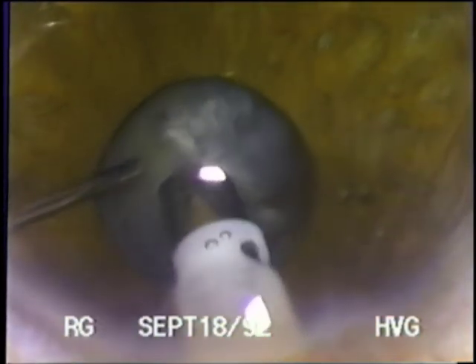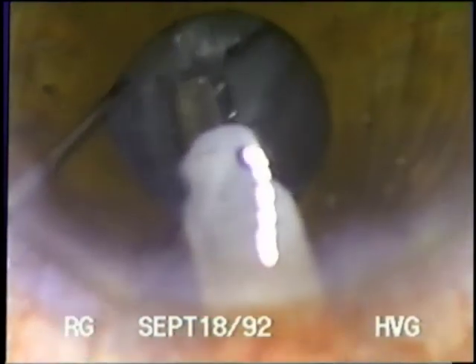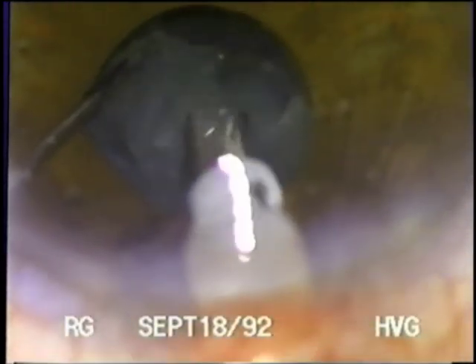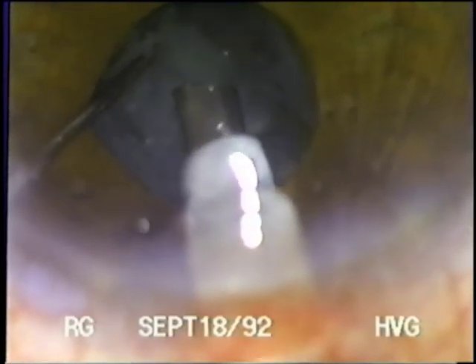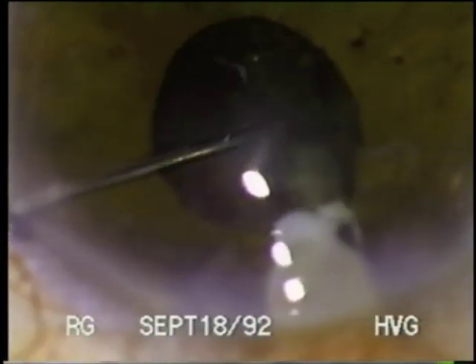The risk of the iris flowing unexpectedly with the lens material into the tip of the phaco port is thus reduced. If the tip is under the capsule or iris, it is usually in irrigation aspiration mode only. It is mandatory to use a lower flow in small pupil cases. It reduces efficiency but increases the safety of phaco techniques in small pupils. After the nucleus has been removed, the remaining soft epinucleus can be removed as a bowl, also with low flow and low vacuum. Firm epinucleus will usually fracture with the nucleus but may remain as a sheet of rather firm material which has to be brought to the center for emulsification.